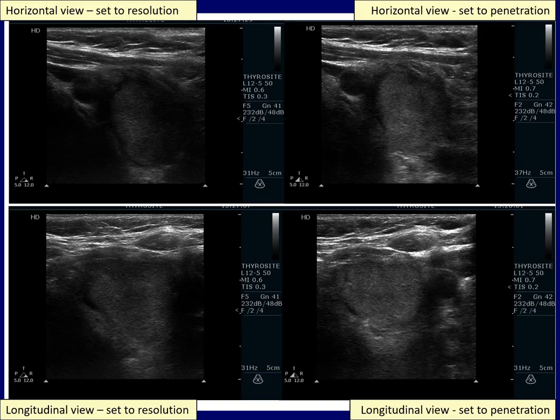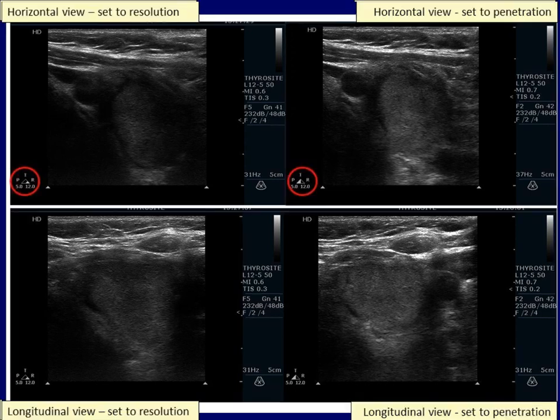This case demonstrates the importance of adequate frequency. In the upper left image, the frequency was too high — in other words, we chose the best resolution. By lowering the frequency, that is choosing better penetrance at the cost of worse resolution, the details of the nodule became better to judge.